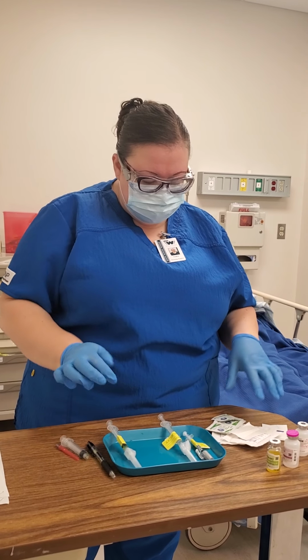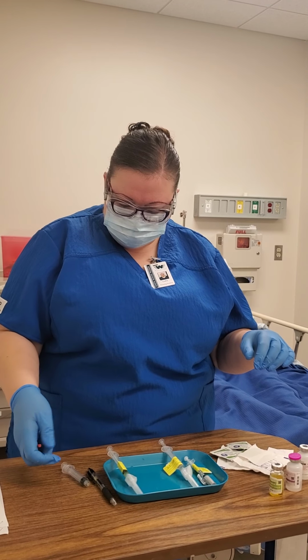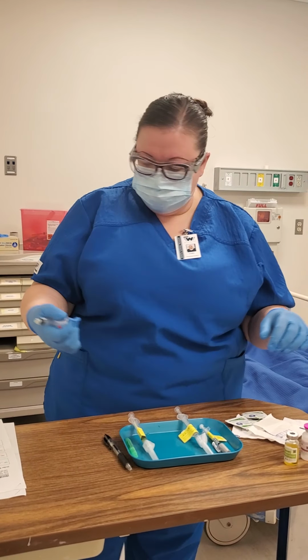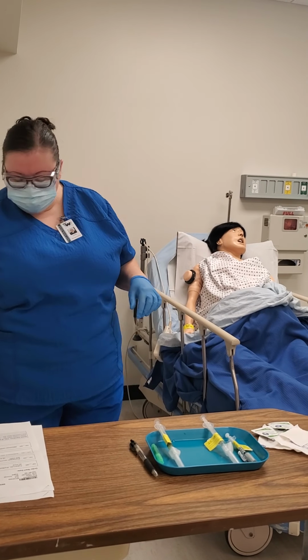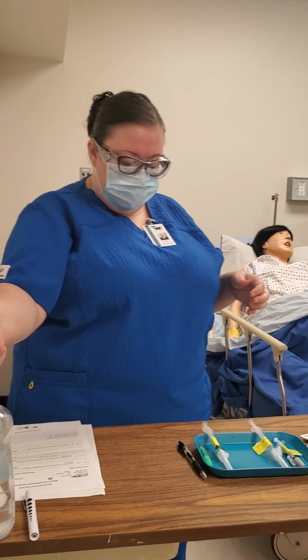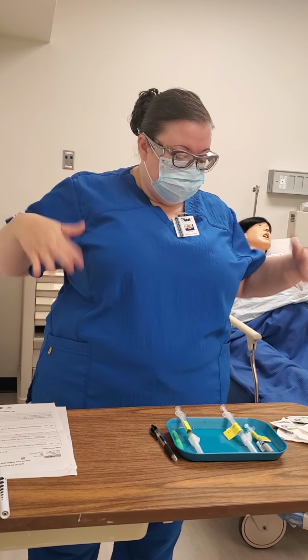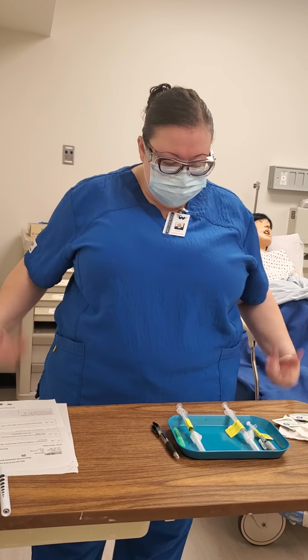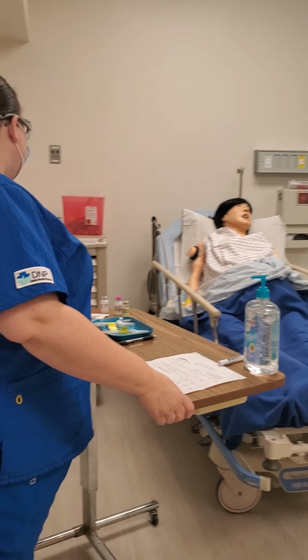So I won't be administering this one, but okay, I'm gonna get rid of some of my needles here. So this one's not open. And I'm gonna re-sanitize because I'm going out into the hallway, into the room. Hands dry a little bit. Okay, and I'm just gonna knock on her door here. Shirley.